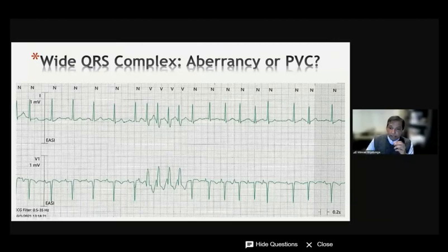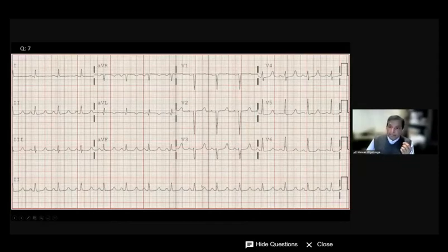And you can see what happens is this patient is in sinus rhythm and suddenly gets these runs of rapid rhythm from the atrium, and you can see it even continues here. The heart rate is faster. There are P waves, and then it suddenly settles in again. And this is not uncommon, even among sick patients in the ICU. These patients a lot of times have atrial tachycardias.